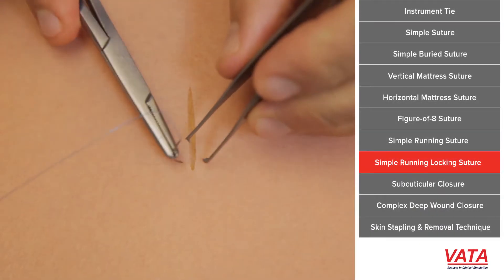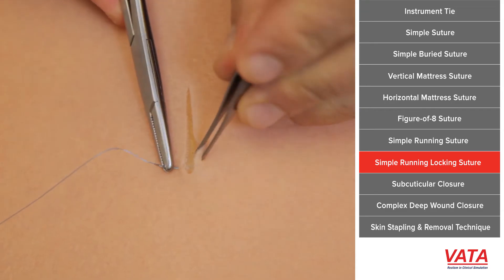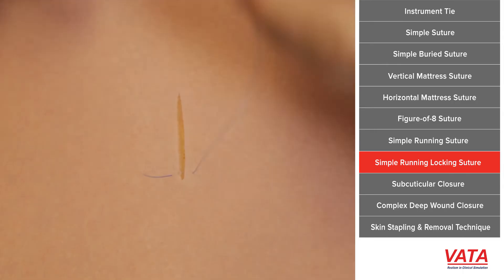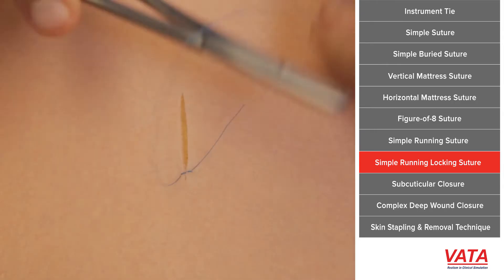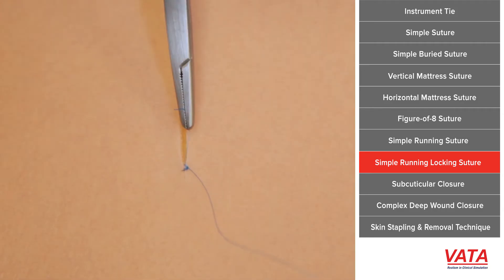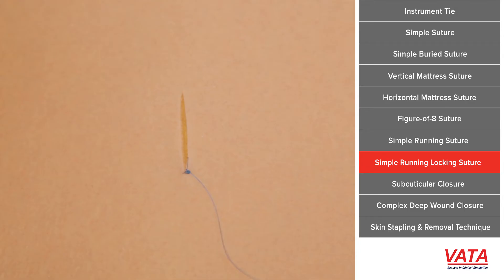One variant of this is what's called the simple running locking suture. Sometimes you are closing a wound quickly — an example would be a big scalp wound where it's bleeding and you just need to get it closed. It's hard because it's gaping open a little bit, and as you start to tie the entire suture it's not staying in place. Sometimes you can have an assistant hold that for you, but when you're by yourself especially, what you can do is lock the stitch each time.